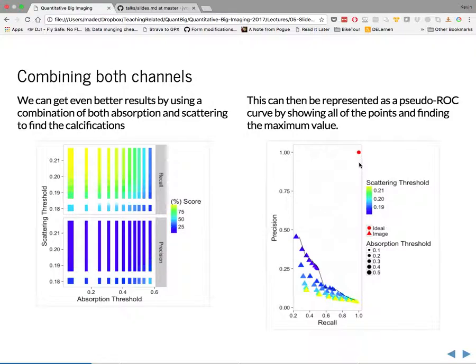In fact, for many of the applications that we'll do later, if you're building something to detect breast cancer or to analyze these images, it's much more important that you get the accurate number of plaques or number of calcifications in the breast tissue.